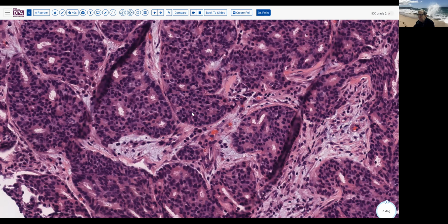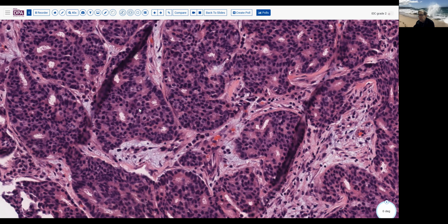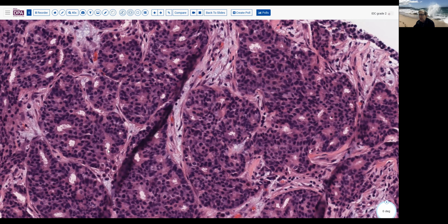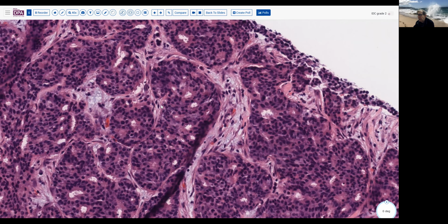So looking at this, again, we see rather high tumor cell density and a moderate degree of nuclear pleomorphism, some intermediate, smaller, and bigger cells in this lesion. In general, invasive cribriform carcinoma tends to be a little bit lower grade tumor than higher nuclear grade, as this appears to be here.